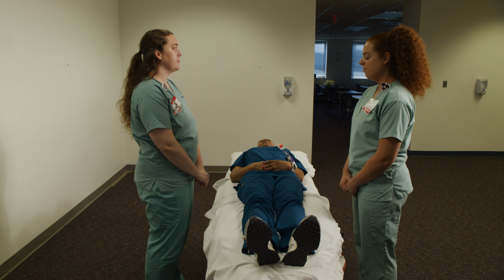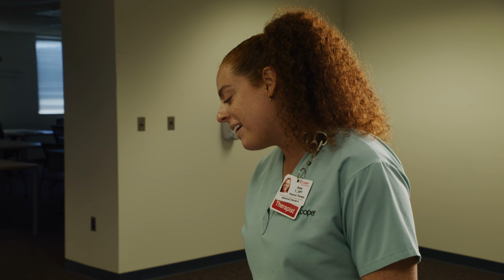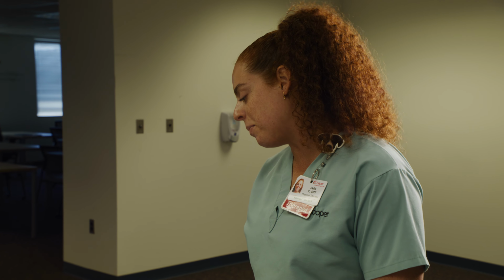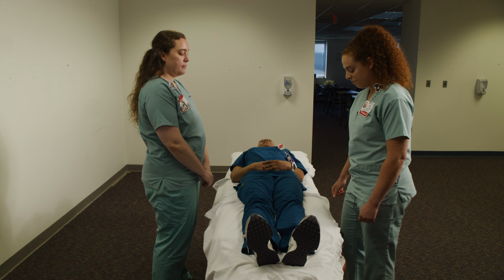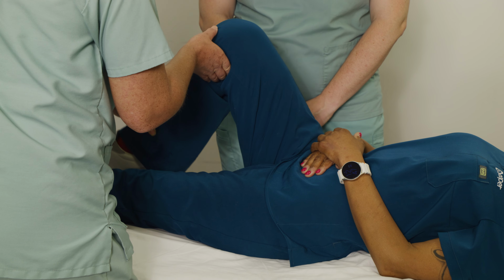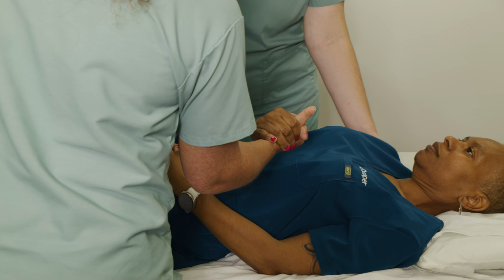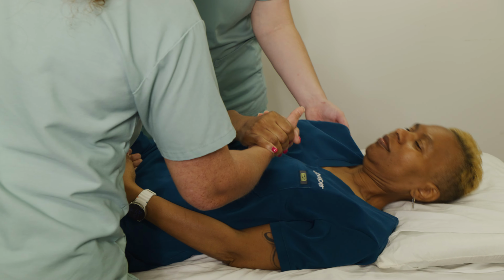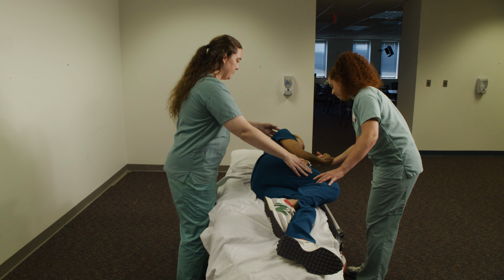We will show you now how to mobilize a patient to the edge of the bed. First, you want to start by introducing yourself to the patient and explaining what the purpose of your mobility is. The next step is to have the patient bend one of their knees. You will have the patient then reach for you or for the rail with the same arm. Now you will turn the patient, have them help as much as they can towards you.